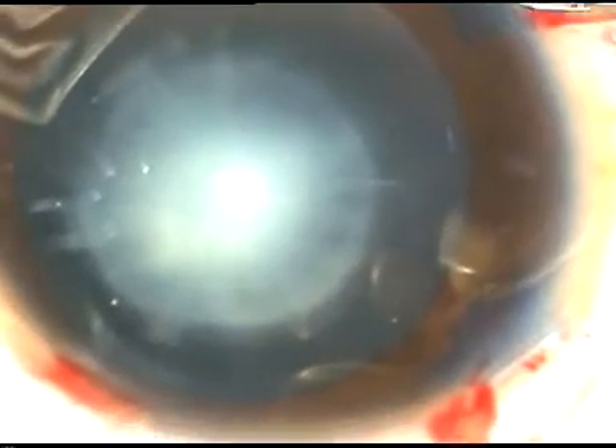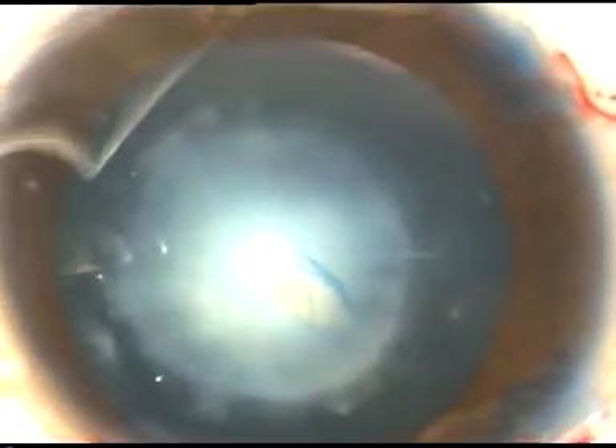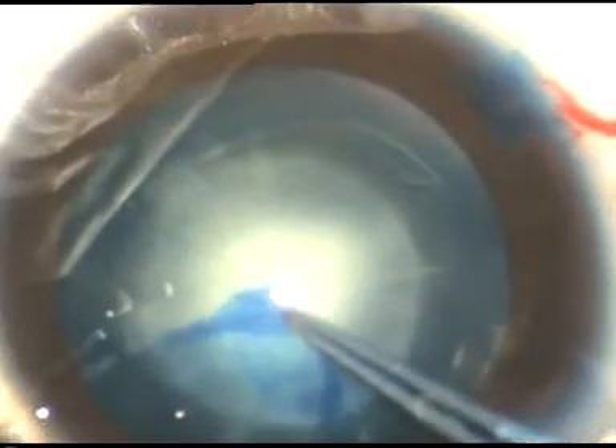See how it is being done. A 26-gauge needle is introduced and a flap is made. Now I hold this flap with the Utrata forceps and go anti-clockwise. The capsule tends to go to the periphery in children, so here I pull towards the center. Again I go a little towards the periphery, and I try to remain along the border of this nuclear cataract, and thus I get a nice rhexis.